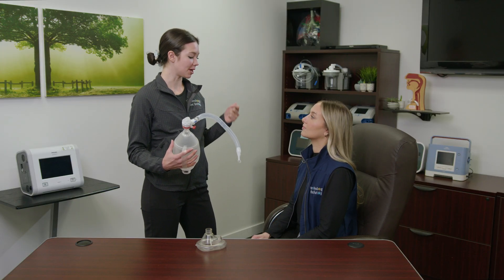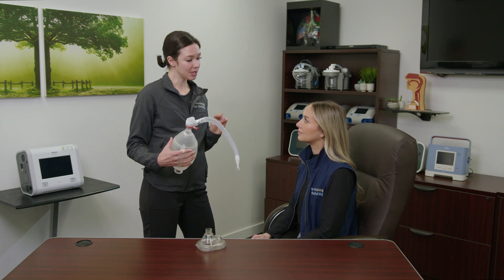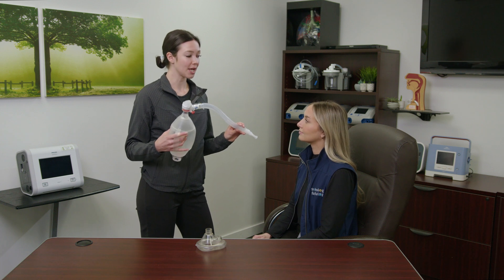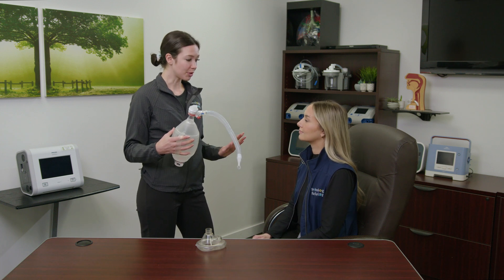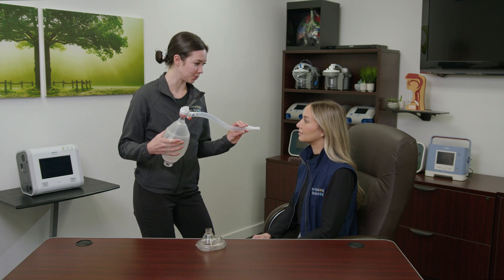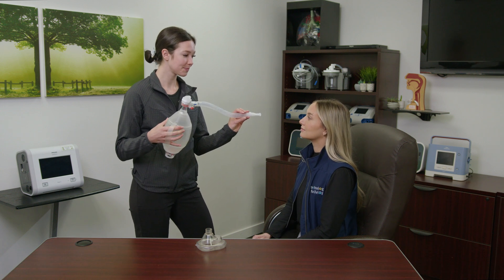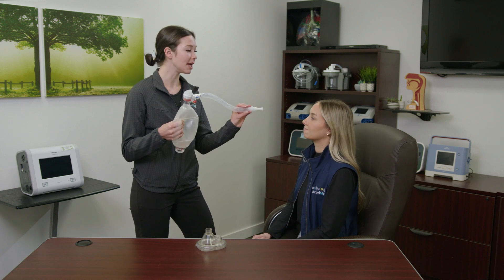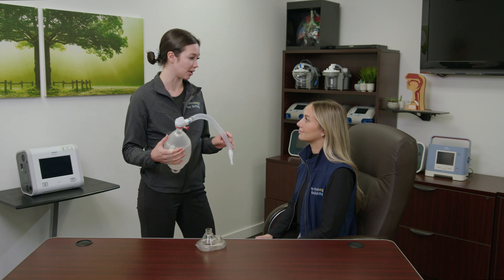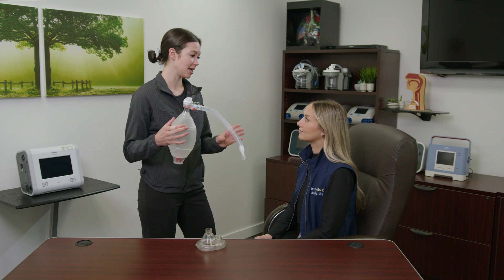We're going to stack three breaths in a row. Put the nose clips on and make a nice tight seal around the mouthpiece. I'll count you in — on three, breathe in and hold your breath between each breath. It will sound like: one, two, three — one, two, three — one, two, three. Then hold your breath for about 10 seconds, or as long as you can, and then exhale. Don't breathe out in between.